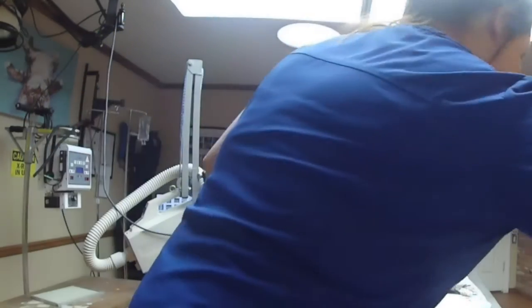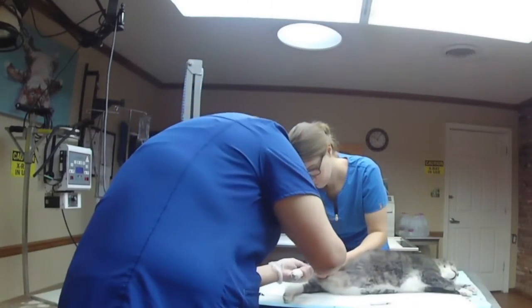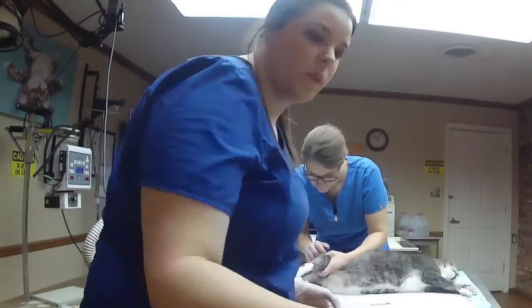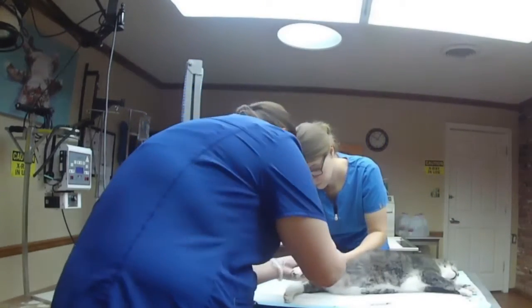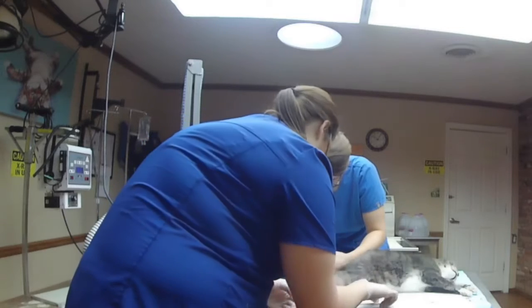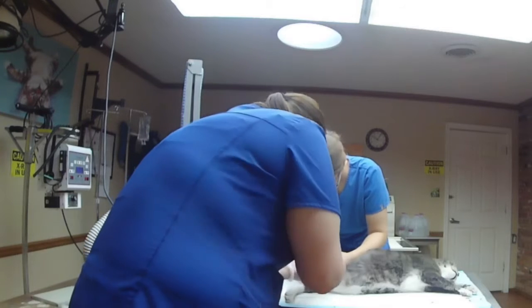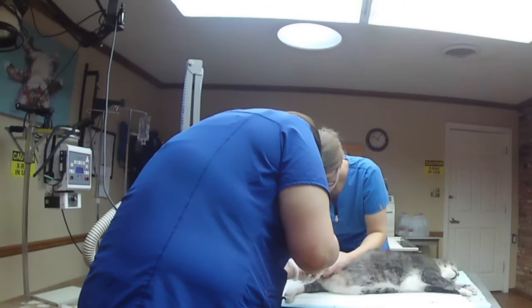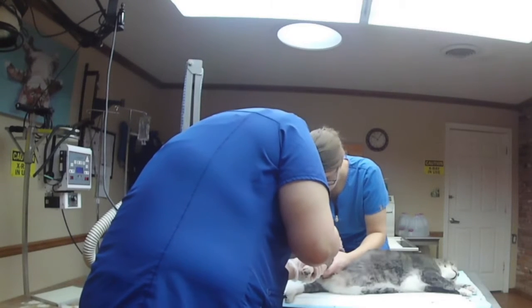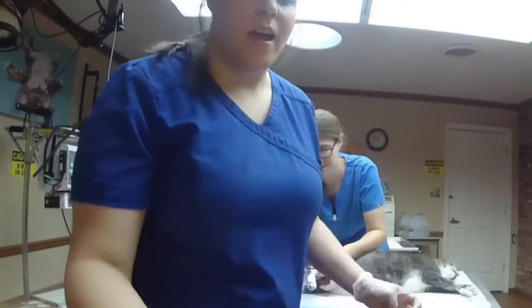How you draw blood on a saphenous vein of a cat. You're going to clean the area with iodine, and then go back over it with an alcohol cotton ball. I'm going to go with the needle bevel up. Oh, there we go. Okay. And that's how you draw blood on a saphenous vein.